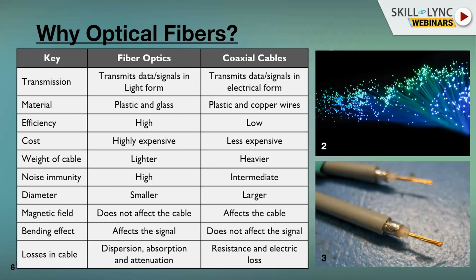So you should have a transmitter everywhere for a certain distance, whereas the loss in the fiber cable is very less. Sometimes if the light is not properly emitted, that means it is not covered properly for the fiber optics, then you will have losses in the signal.